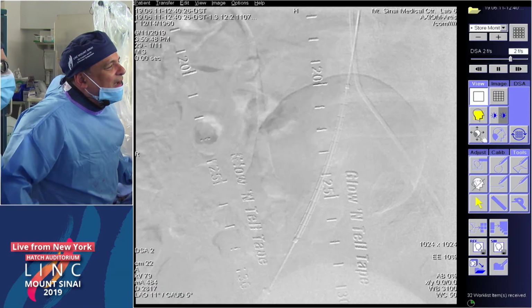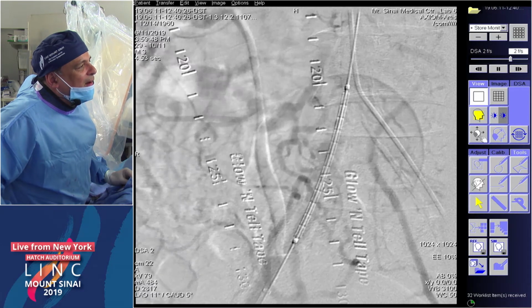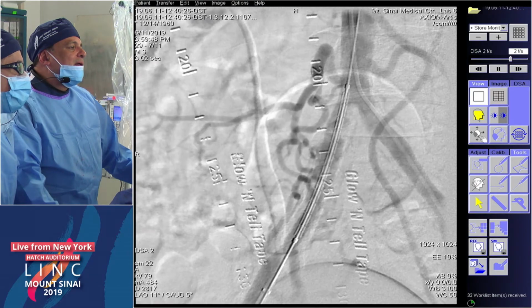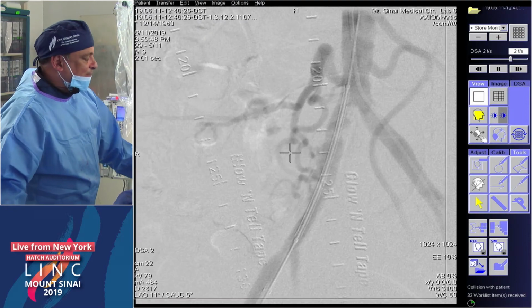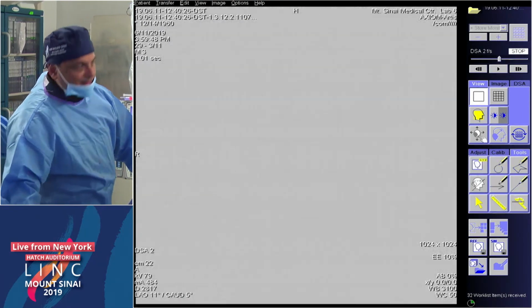I'm good there. Could you run it one more time? Yes, it's coming right now. I think you come back a hair. Well, he did come back. That's the one. I see. You haven't reshot. That's before you pulled back a little bit. Yeah, but I want you to see the location of our hypo. That's kind of the balance, right? Right, and that's why I wouldn't come back any further. I think you're good here.